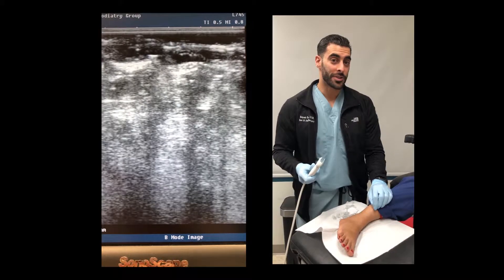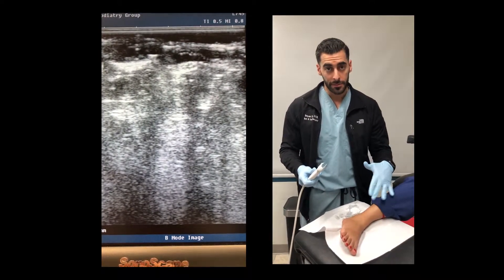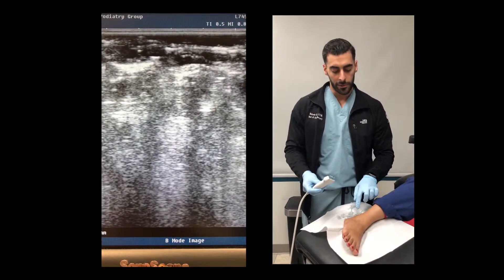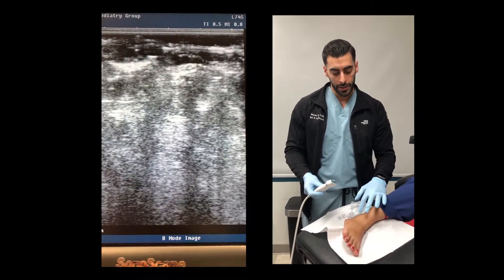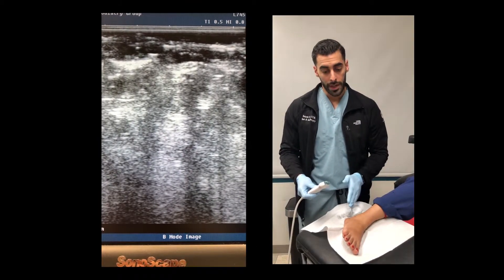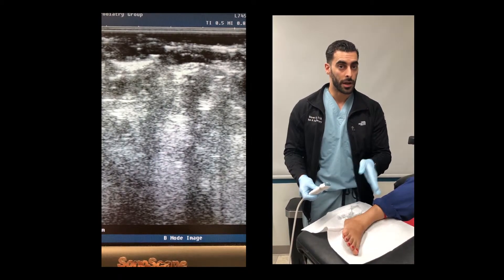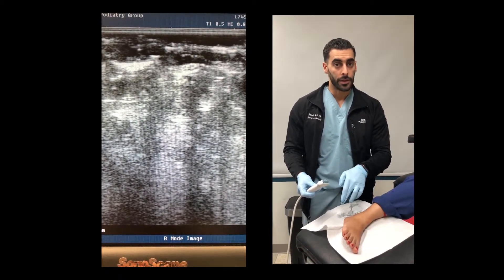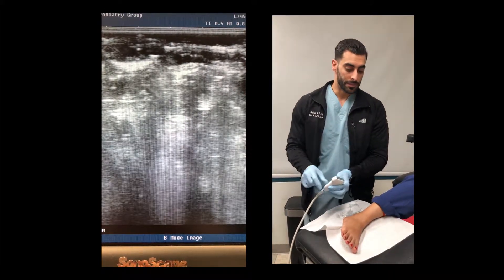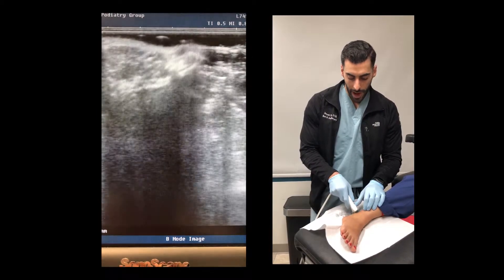Now I'm going to show you how you can use an ultrasound to identify the peroneal tendons. I like to use a system similar to how I use it with the Achilles tendon, but I like to start from the retromalleolar area, just posterior to the lateral malleolus, and work my way down. The peroneus longus will dive down underneath the cuboid, and then you'll see the peroneus brevis insertion into the fifth metatarsal base. I'll start transversely or axially.